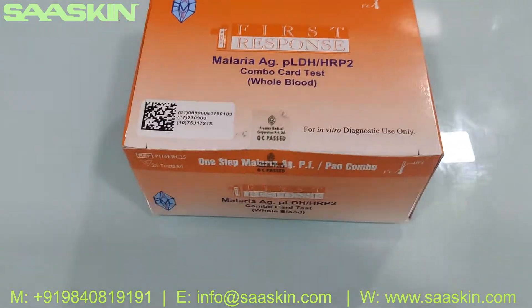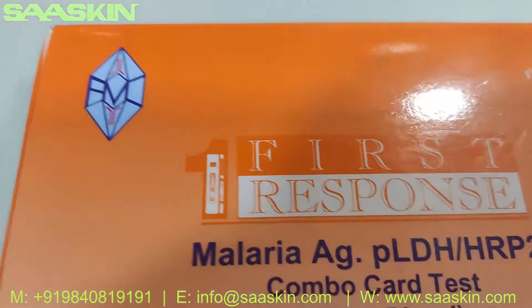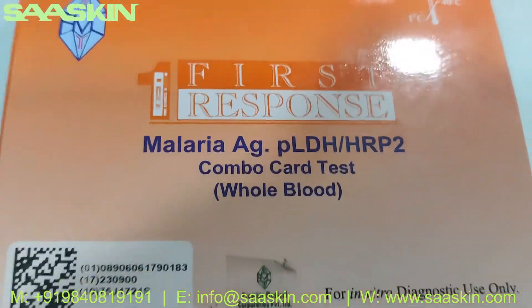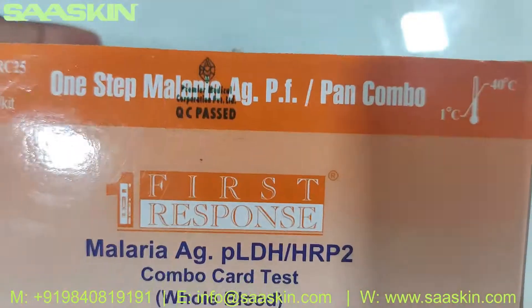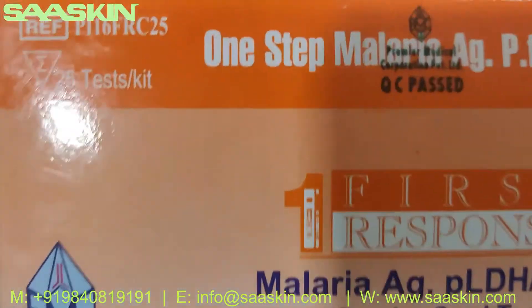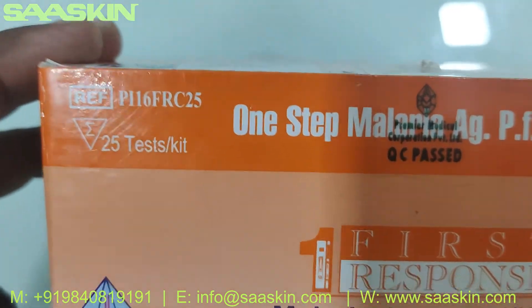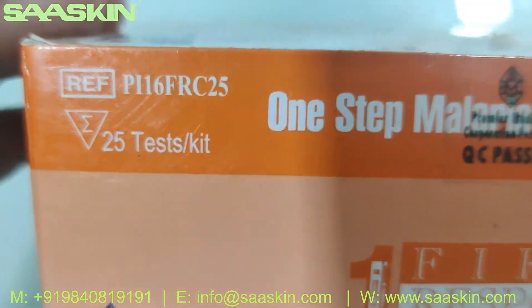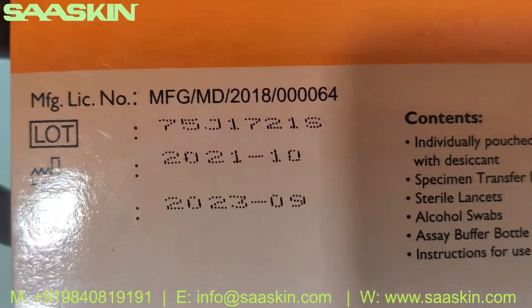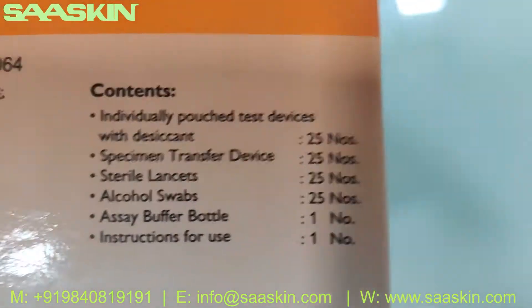Hello everybody, today we're going to see the unboxing of the First Response Malaria Antigen Combo Card Test. You can see that this is the Malaria Antigen Pf Pan Combo. This is a WHO-approved kit with 25 tests per kit. The box standard shows it has a two-year validity.